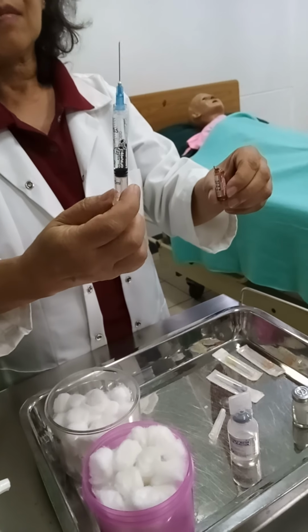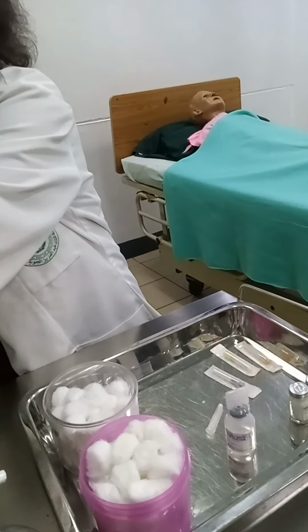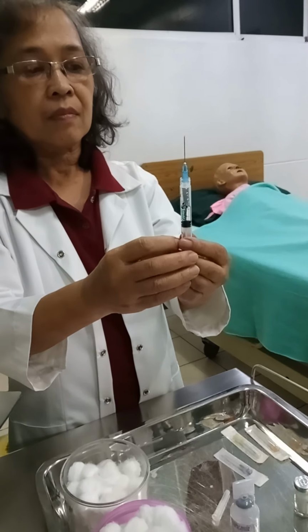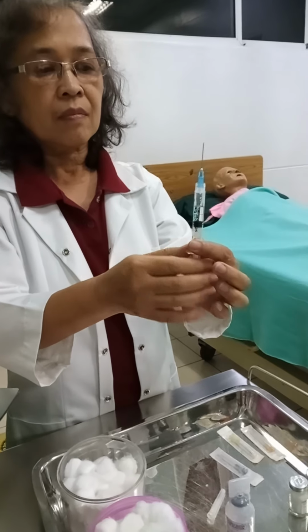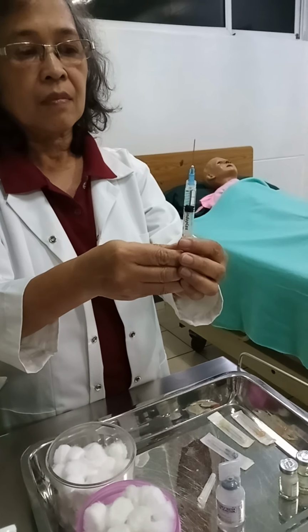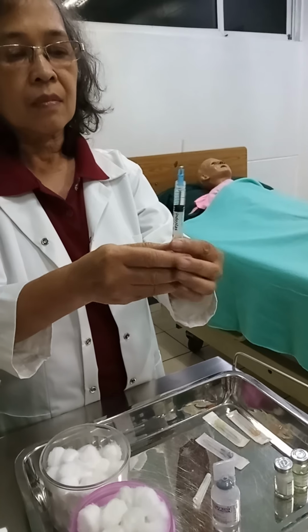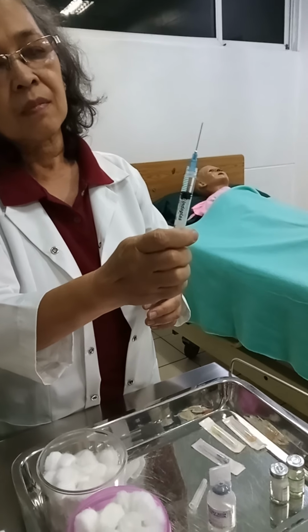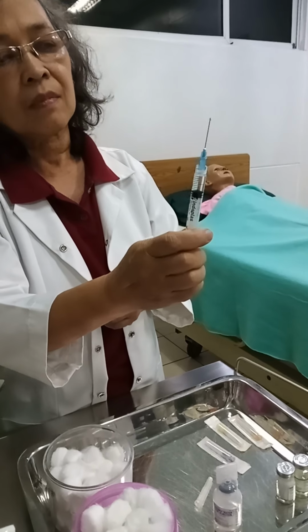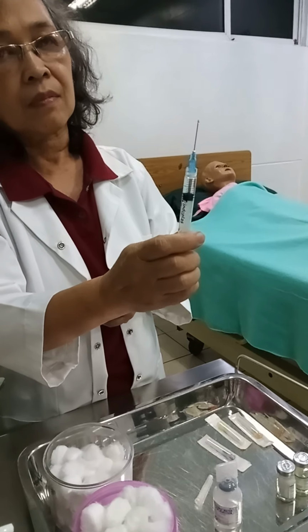If air bubbles are aspirated, do not expel air into the ampule. To expel excess air bubbles, remove the needle from the ampule. Hold the syringe with the needle pointing up. Draw back lightly on the plunger and then push the plunger upward to eject the air. Do not eject fluid.